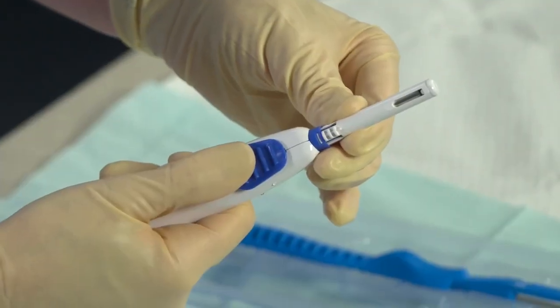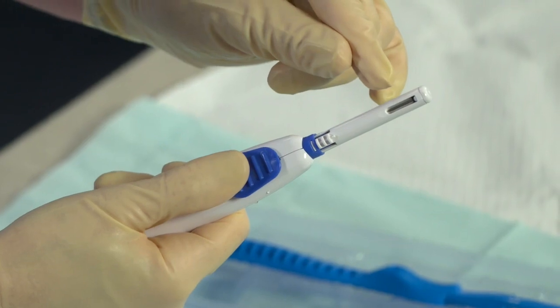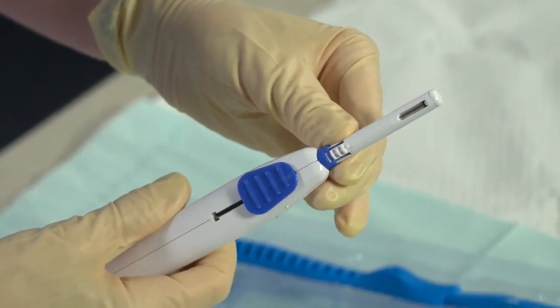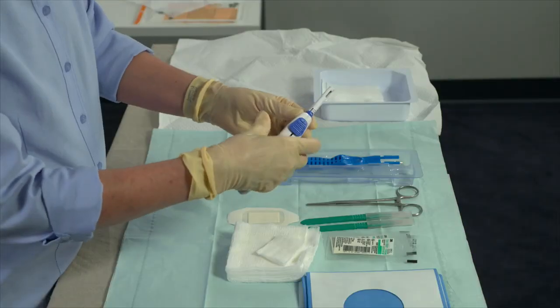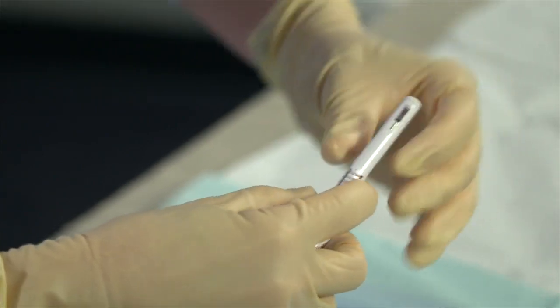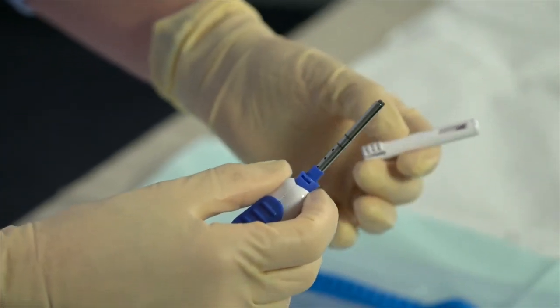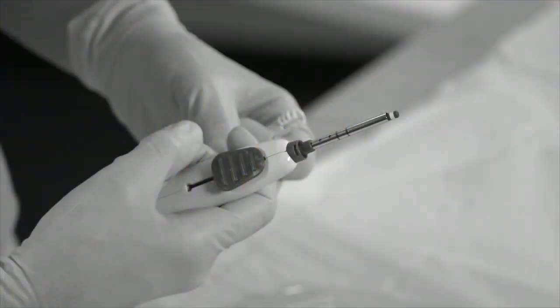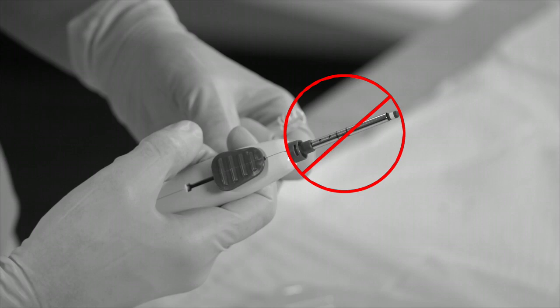Keep the blue slide in the forward position. You'll note that the cannula, which now covers the sensor, is visible through the slot in the sensor holder. Next, remove the sensor holder from the insertion tool by squeezing and pulling on its ridged portion. Be sure to visually check that the sensor's tip is nearly flush with the end of the insertion tool. It should not be more than about a millimeter outside the cannula. Use a new sensor if it is improperly loaded or drops out of the insertion tool.